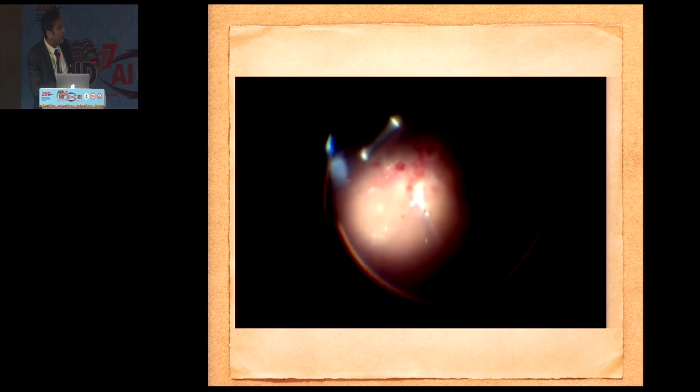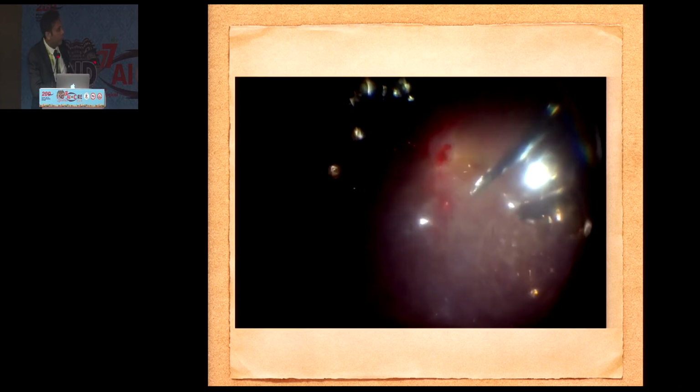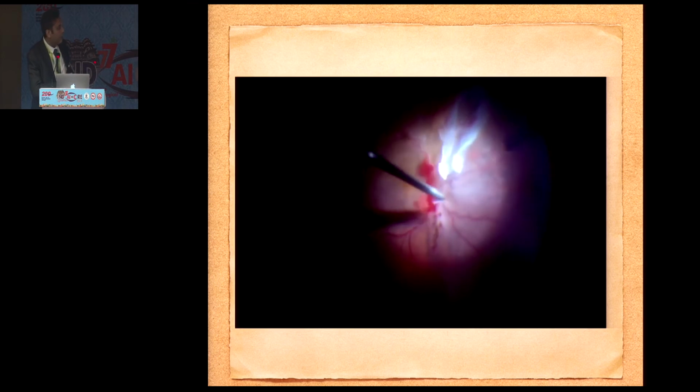In this case, there were numerous small bleeders around the arcade. So again, cautery was not used, and a small amount of triamcinolone after the dissection was injected, and it also acts as a coagulum to the few bleeders, and it can be done.